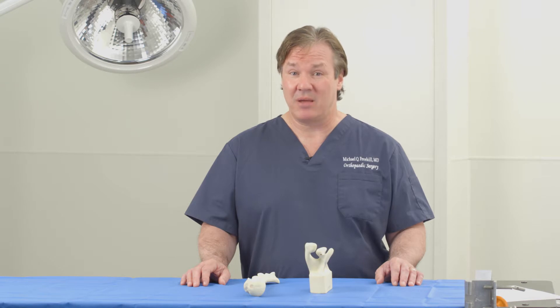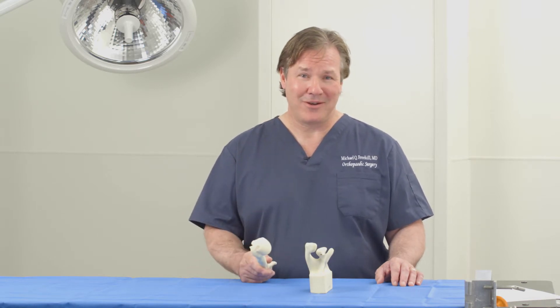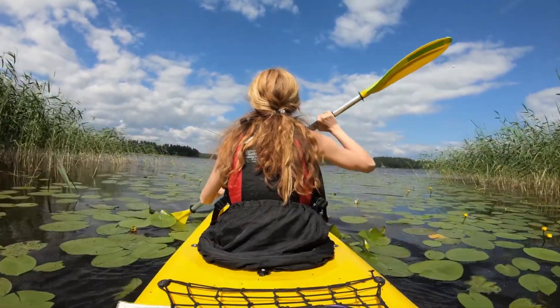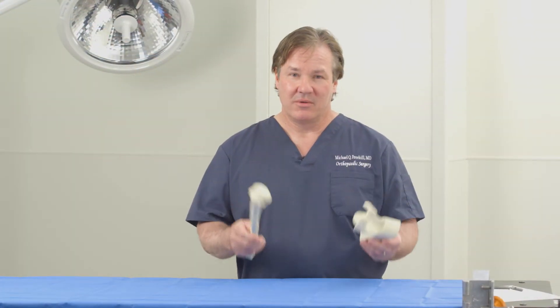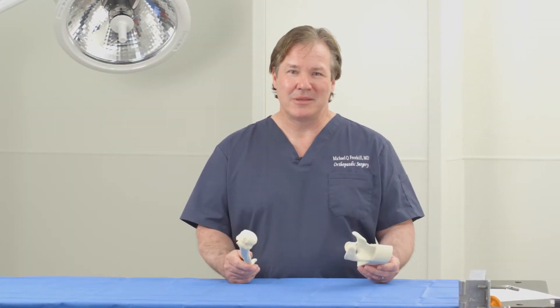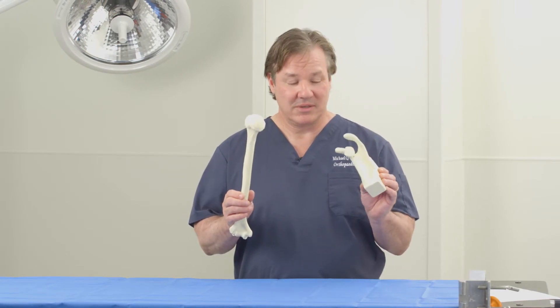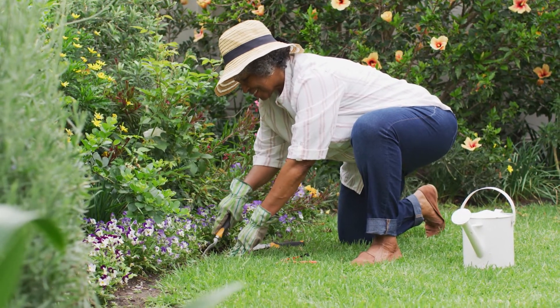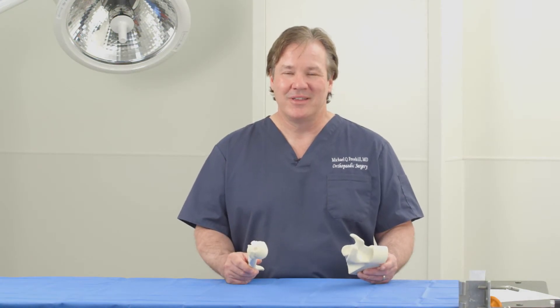Today, however, we'll be using sawbones — not quite hard as a rock, but pretty darn close. The benefit of a sawbone is it gives us a fairly similar opportunity to show surgical procedures without the bloody gore that some of you might not be comfortable with. So today we'll be using these types of instruments to show shoulder replacement surgery in its variable forms.